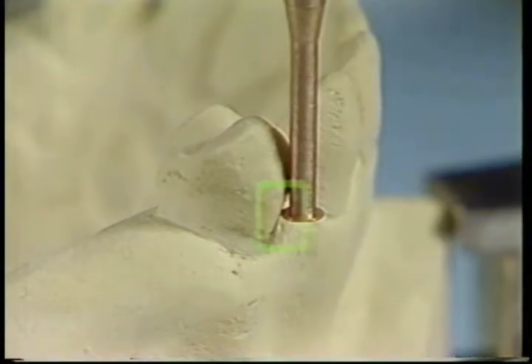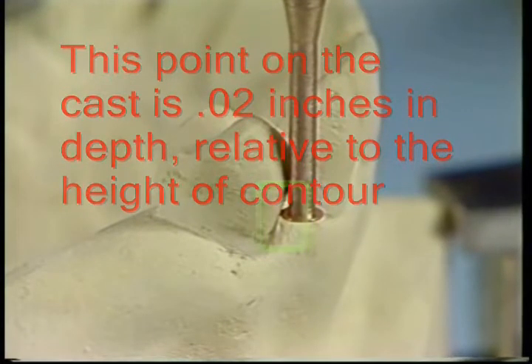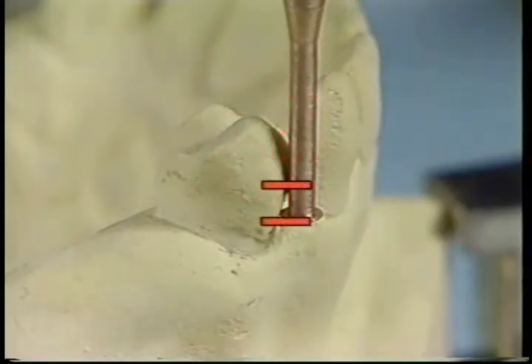At this point, .02 undercut exists. The surveying procedure may be repeated several times to find optimal locations for guiding planes, undercuts, aesthetics, and avoidance of interferences.